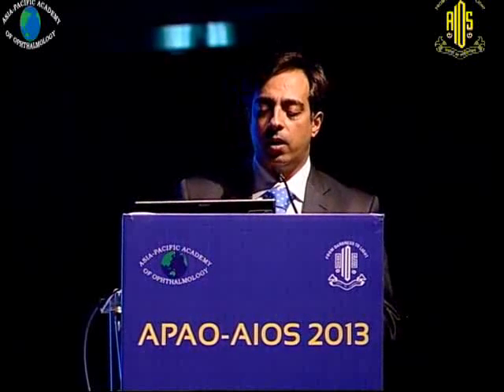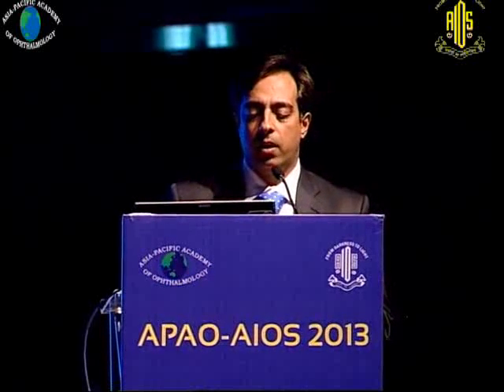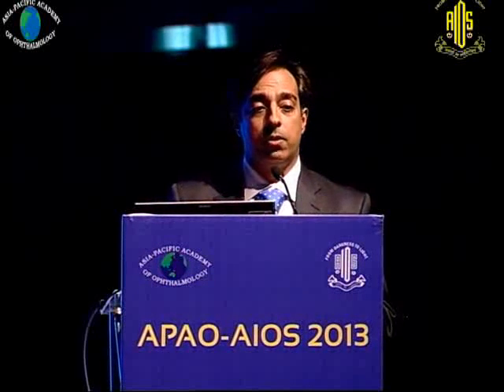This is also immediately after the PVD creation in a macular hole, and you can see that we've ripped a whole tear in this area, which is ragged. Now this is a pathological adhesion. It's like a thinned out area which had a vitreous adhesion and has given way just because we pulled at it.